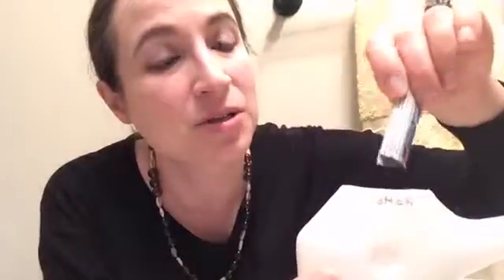All right, so here I have a sinus rinse kit packet, and these packets are designed to have salt and bicarb that is exactly matched for the common sizes of neti pots that are available. So we're going to take that and put the salt bicarb mixture into the neti pot. Another key point is you can also use regular salt as well. Whatever you use, you want your solution to end up being approximately the same saltiness as your own tears, so that there is no stinging of the sinuses.